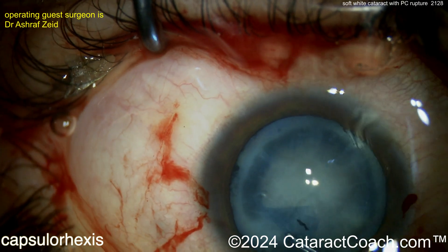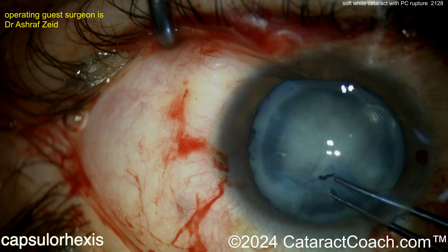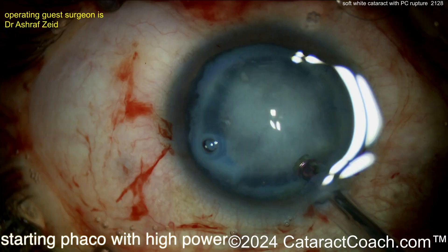As that rhexis goes around, you can see there's not a lot of lens milk coming out — not a lot of liquefied lens cortex, but it has certainly been opacified. In a case like this, you definitely want to make sure you get a good rhexis completed.